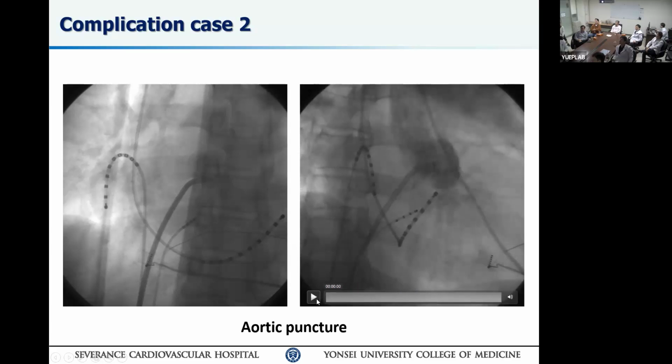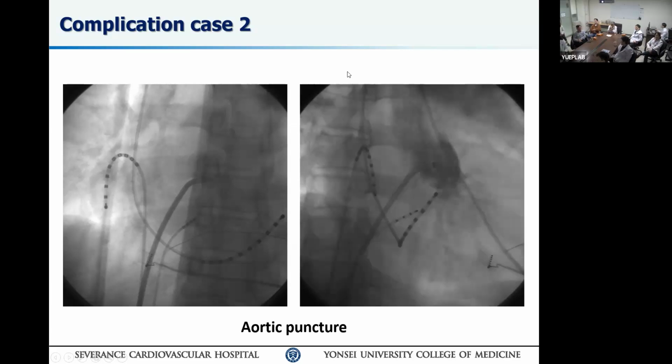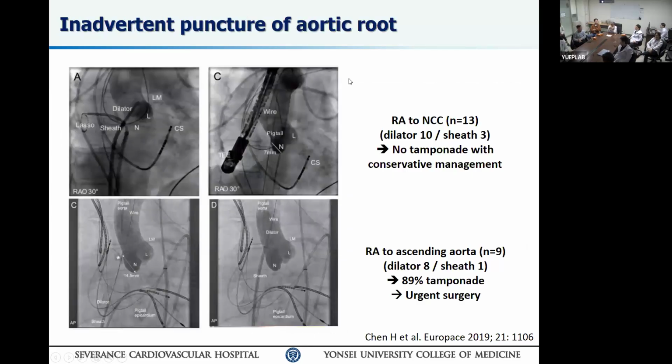Because you can see the reconstructed valve there, it's just above the Valsalva. That one, you don't want to touch. Just let the surgeon handle it. Even though it does not leak, I don't think you want to pull it off.